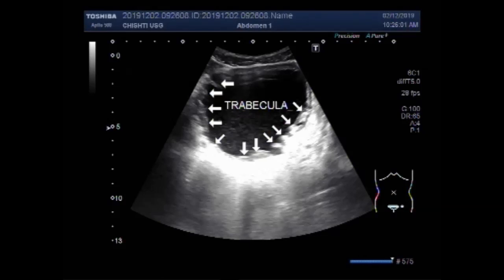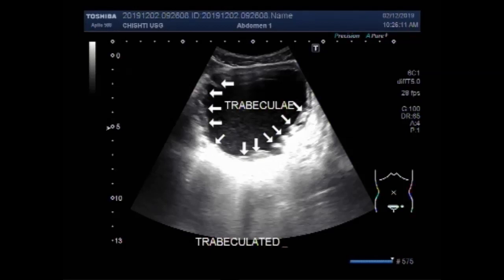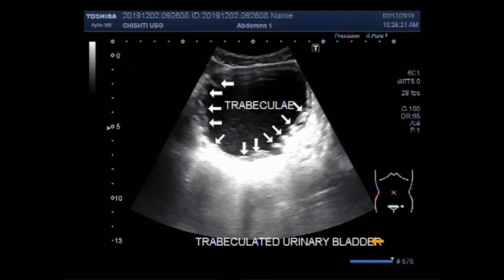These trabeculi occur from repeated obstructions in the urethra. When the obstruction occurs, the muscle wall of the urinary bladder has to work too hard to move urine, so this leads to thickening of the muscle walls and loss of elasticity.